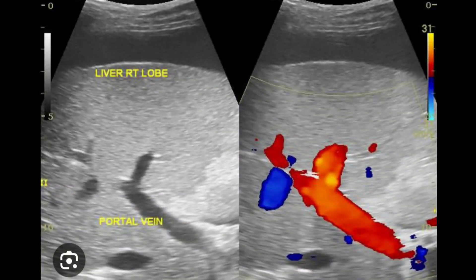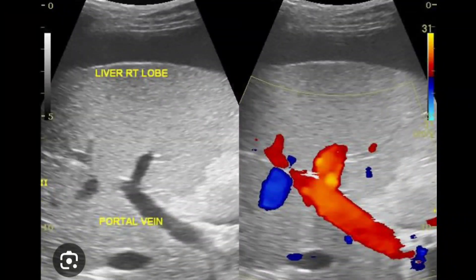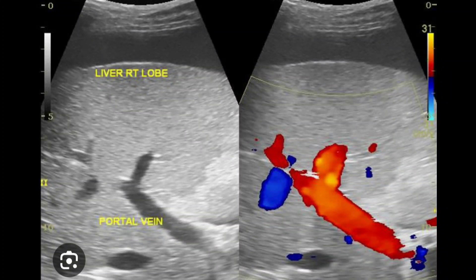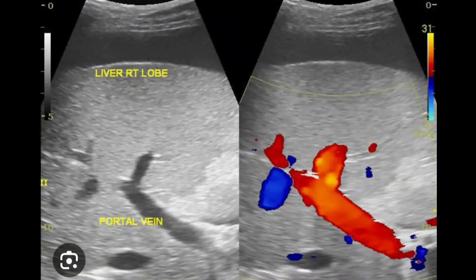This is a transabdominal scan and here you can appreciate the Doppler signal indicating that the main portal vein mean peak velocity is less than 10 cm/s, which is also an indication that the portal vein is dilated — portal venous hypertension. Another point on this slide is ascites; look for the superior border of the liver where ascites is visible. As mentioned, in portal venous hypertension there will be dilated portal vein, portosystemic venous collaterals, ascites, splenomegaly, and recanalization of para-umbilical veins.